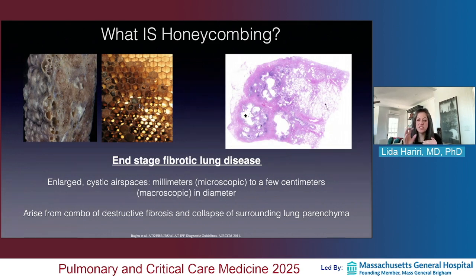But importantly, these honeycomb cysts are isolated from the pre-existing tracheobronchiolar tree. So they're isolated cysts, often mucin-filled, often lined by respiratory epithelium or squamous epithelium, depending on the level of injury that's happened in that space. But they're isolated, which again is why the fibrosis destruction and the honeycombing there impede the gas exchange propensity within that specific lobule of lung.